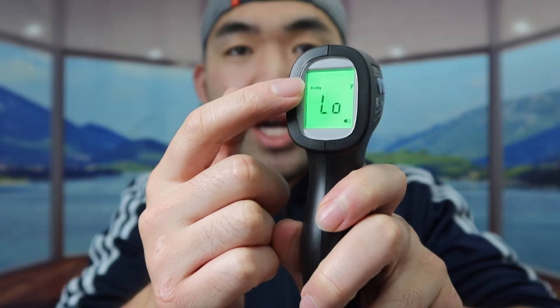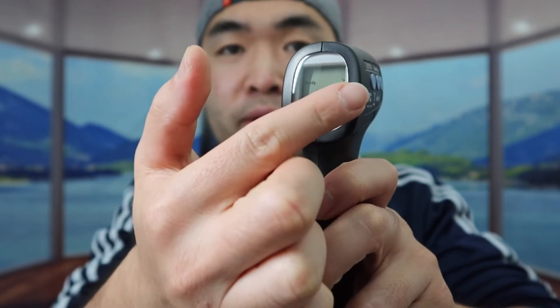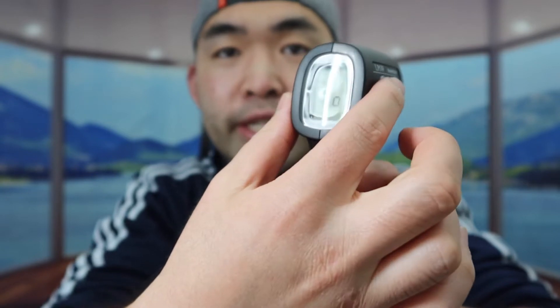The cool thing about this product is that not only can you use it on yourself, but you also have the option to use it for food, cooking, or anything else. If you notice on the product it shows Fahrenheit — if you want to change to Celsius, you basically want to press and hold the set button for 3 seconds.